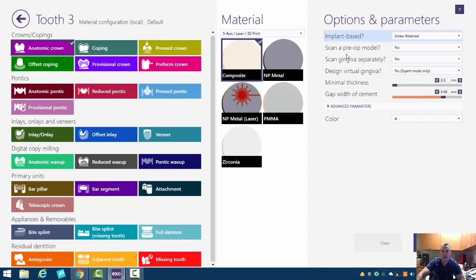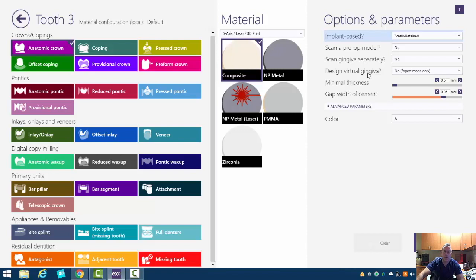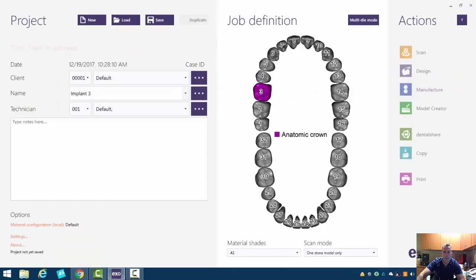Do you want to scan a pre-op model? No. Do we want to scan the gingiva separately? That's if you're importing a gingival mask from a lab case. So we don't want that either. Design virtual gingiva. Well, this is a very cool feature. But in this case, we've got a fairly good crown to implant ratio. And so I don't anticipate needing virtual gingiva. So we'll hit OK.